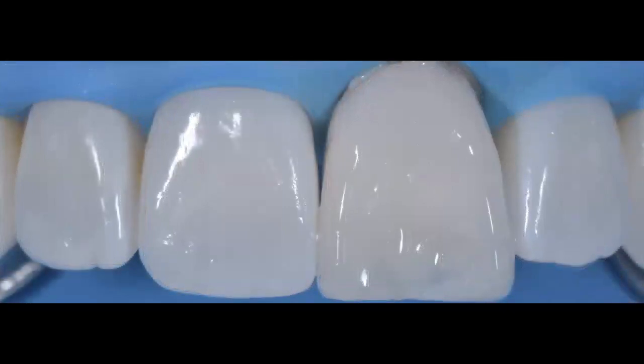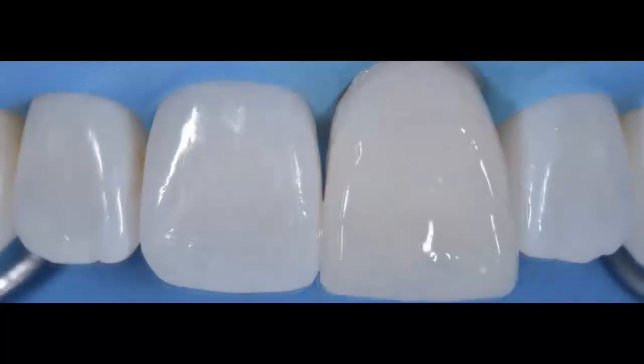We did the mesial mylar pull technique, the distal mylar pull technique. I'm not going to talk about the specifics of the mylar pull technique. I have a couple of videos here on my YouTube channel that you can go back to and watch, where I go into details of this mylar pull technique. One that comes to mind is a webinar that we have on composite veneer restorations. You will watch me do that live on a dentiform, how to pull the mylar to the mesial and to the distal to recreate these line angles as you are seeing here. And then finally, we just do our final facial increment. And once we do that final facial increment, we are done with our restoration.